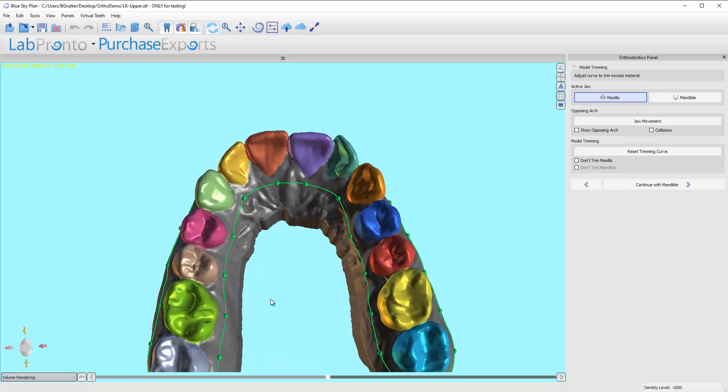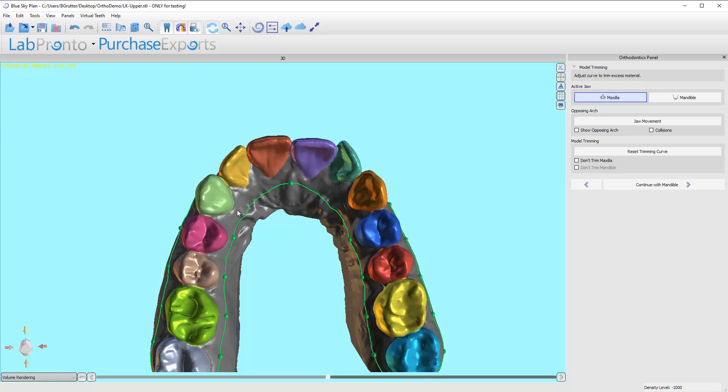The very first thing I'm going to do is go to this anterior area — the same for upper and lower. I'm going to move one node right to the midline on the upper; it's going to be this incisive papilla. I'm going to right-click on this node to make it disappear, and this node and this node. Basically I want one node apical to the first premolars and along the midline, which creates a nice arc or arch here.